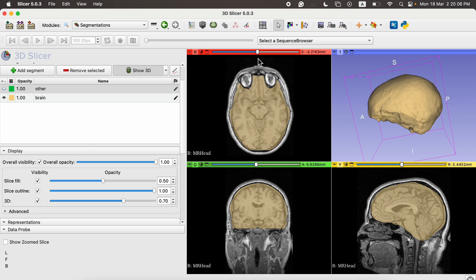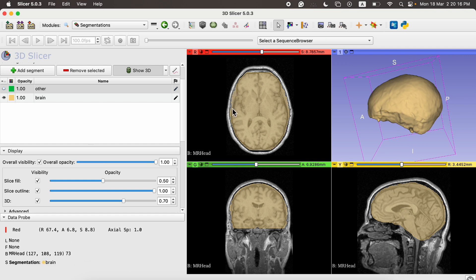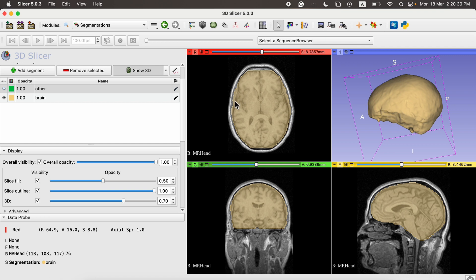Semi-automatic methods provide brain slices more effectively than fully manual segmentation. However, there may be some mistakes — regions outside the brain can be included because it is not a perfect semi-automatic process. To avoid unwanted regions, we can go towards fully automatic AI segmentation modules. In the next section we'll explore how to use AI-based segmentation for fully automatic brain segmentation.